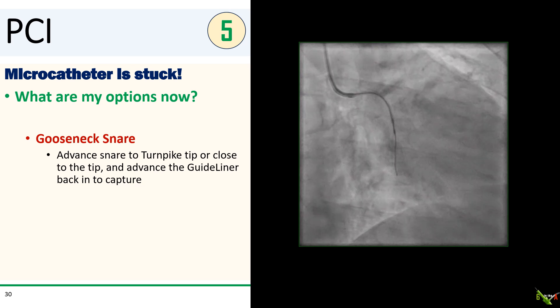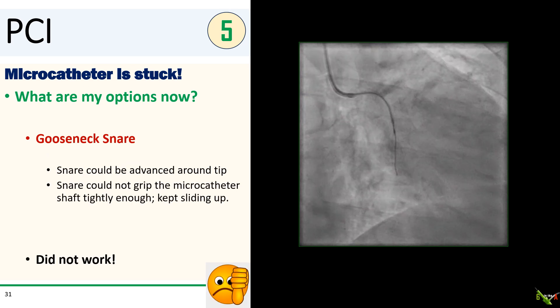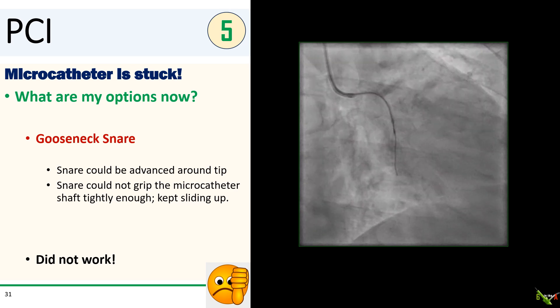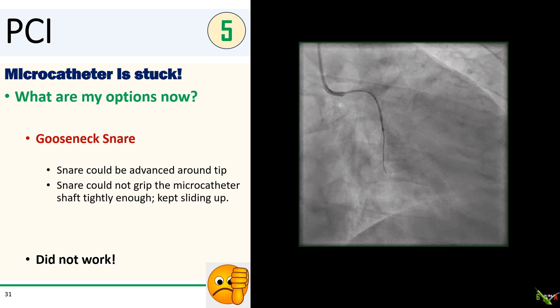Next, we tried to snare the tip of the microcatheter with a gooseneck snare — and not particularly surprisingly, we could not get the gooseneck snare to go around the tip of the Turnpike. I tried snaring the shaft near the tip, but the snare could not grip the shaft snugly enough and kept sliding up as we pulled.